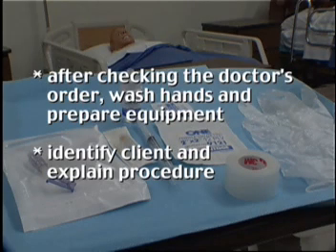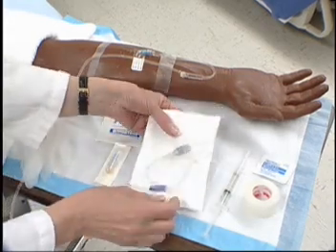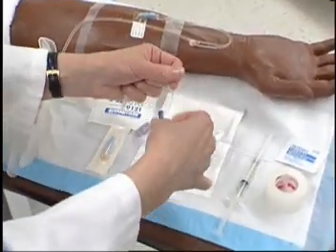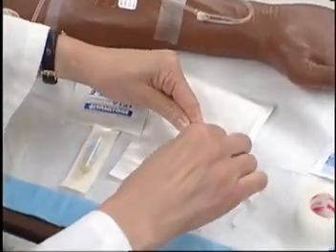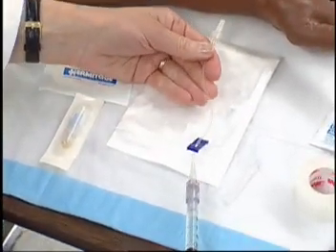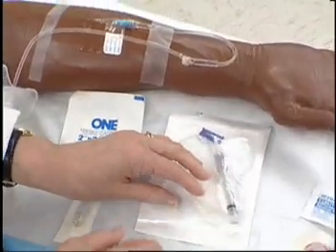Identify the client and explain the procedure. Prime the injection port or extension tubing with injection port with normal saline. Keep syringe attached. Don clean gloves.